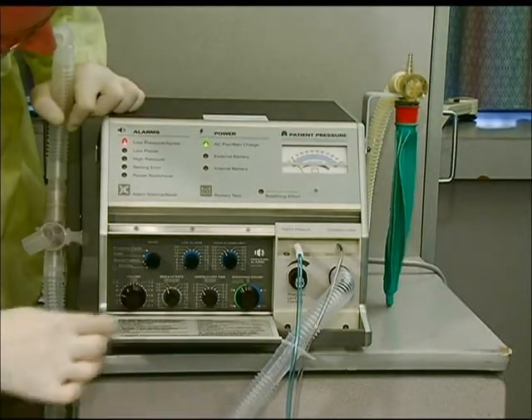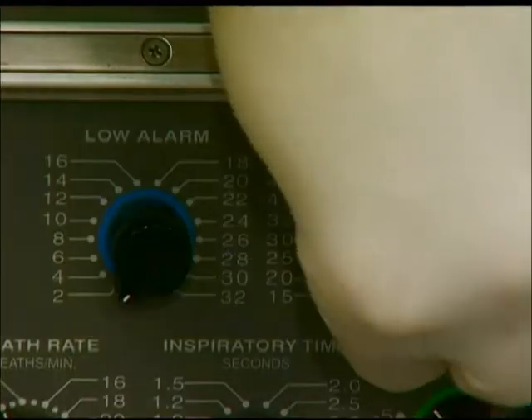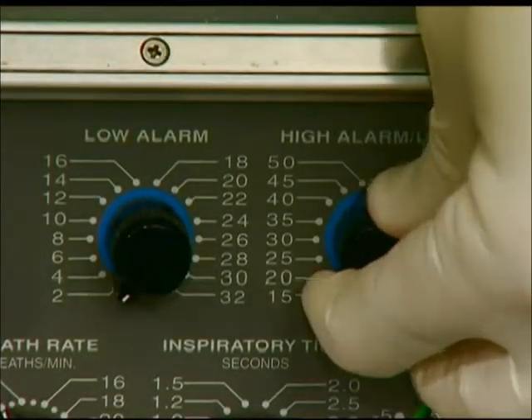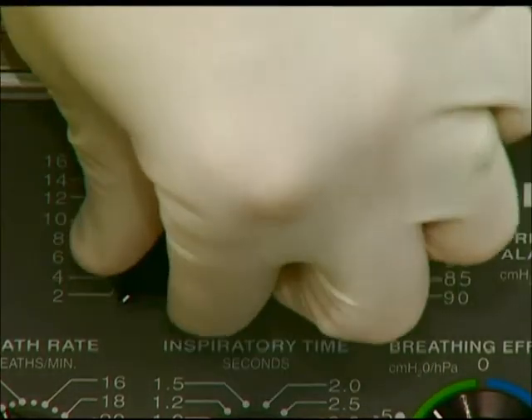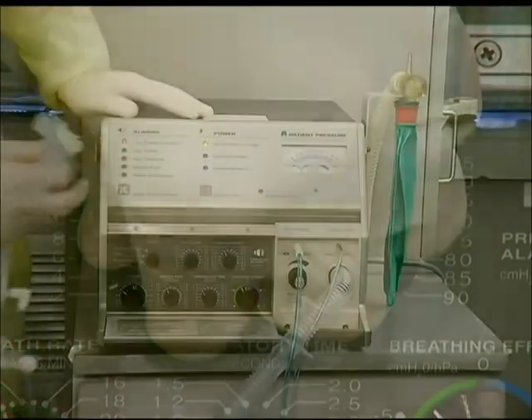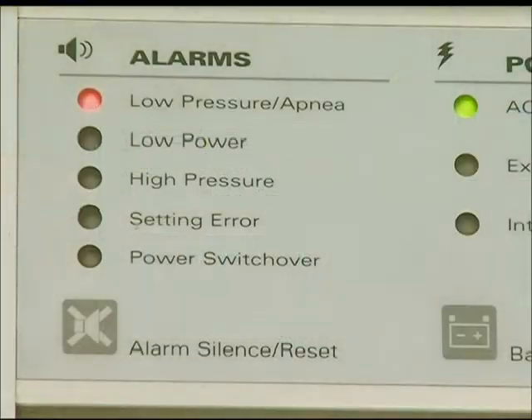Once the parameters are dialed in, set the high and low pressure alarms. Generally, 50 centimeters of water for the high and 4 centimeters of water for the low is an appropriate place to start. Once complete, occlude the patient end of the ventilator circuit with a gloved hand. After a delivered tidal breath, you should see the previous low pressure alarm change to a high pressure alarm. If the alarm panel still indicates a low pressure, check circuit connections because there may be a leaking or disconnected tube.